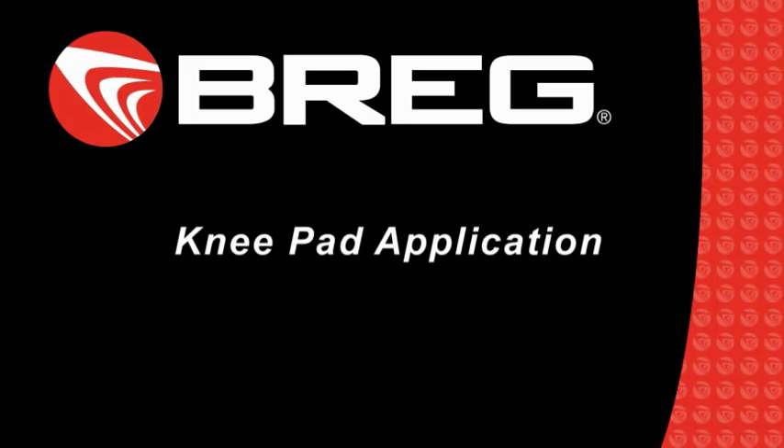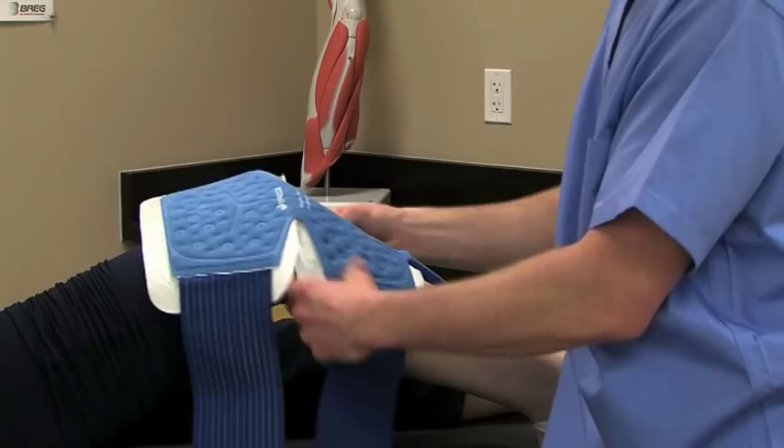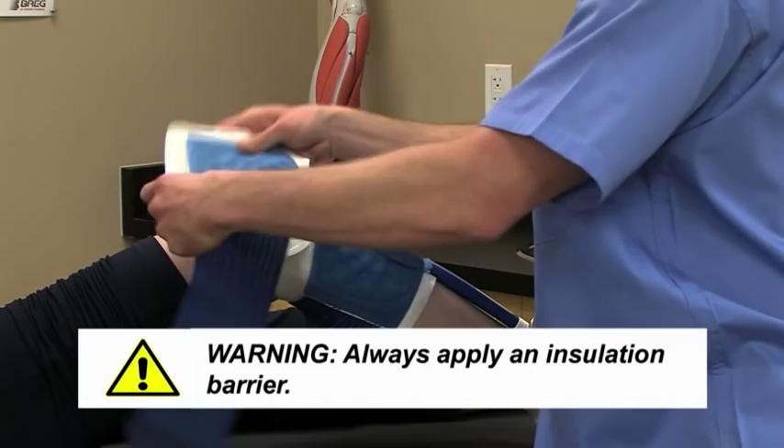This video explains how to properly apply a PolarCare Knee Pad. Whether you're using a Breg IntelliFlow, Wrap-On, or PolarPad, the simple application steps are all the same.